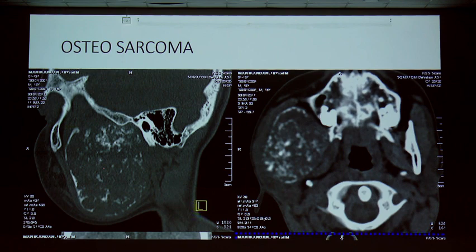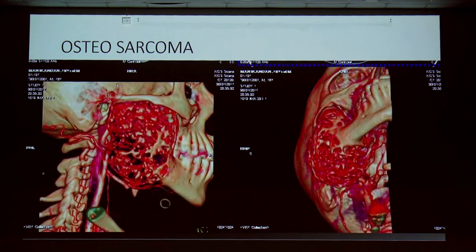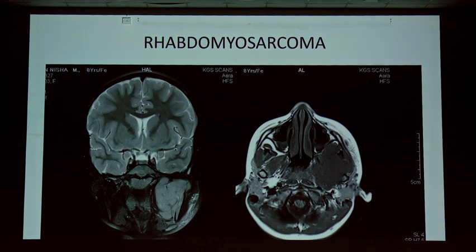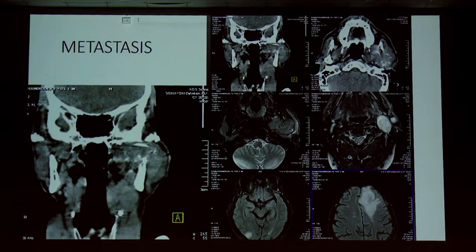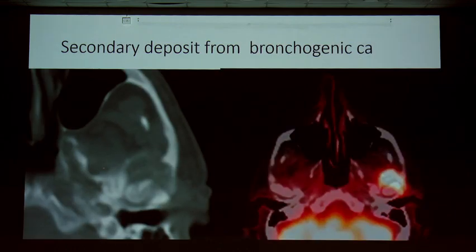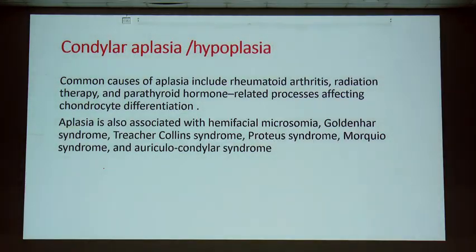Osteosarcoma can occur in the condyle as well as the rest of the mandible. Rhabdomyosarcoma from the muscle can cause condylar destruction — embryonal rhabdomyosarcoma in young children is a classic example. Metastasis can also occur: a case of bronchogenic carcinoma with condylar destruction and cerebral metastasis, beautifully demonstrated on PET-CT with high SUV uptake.